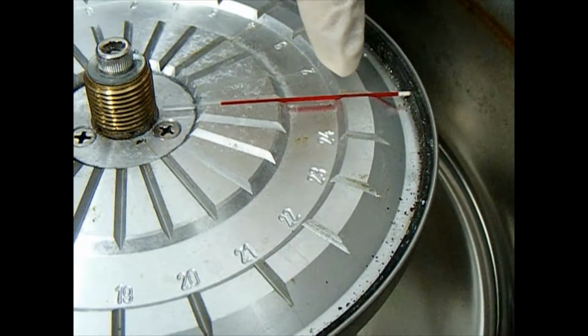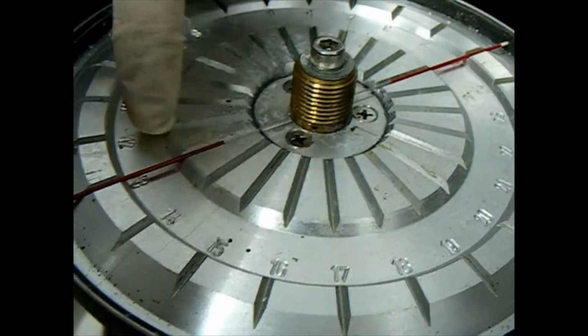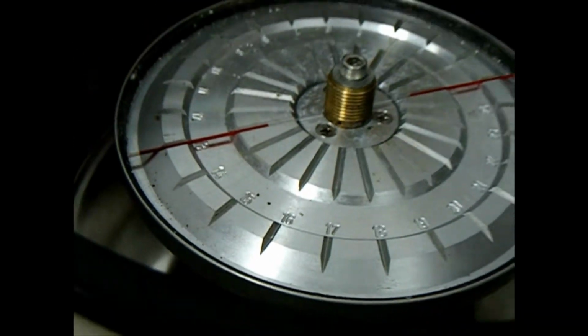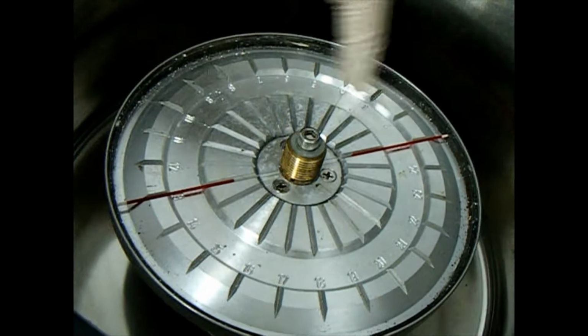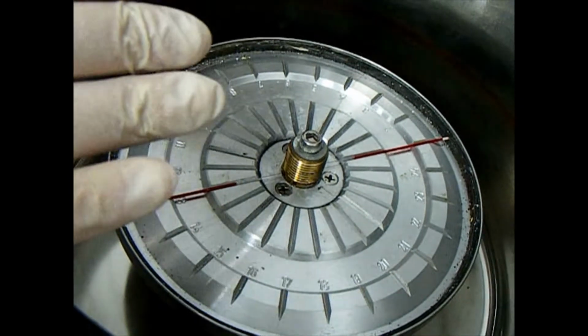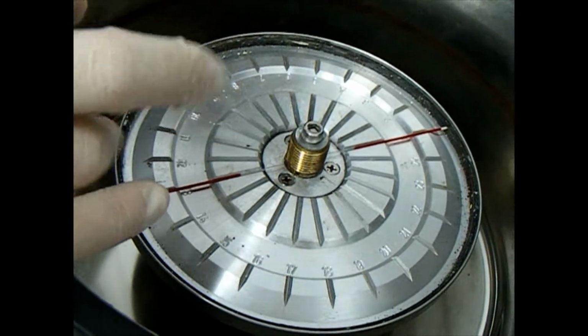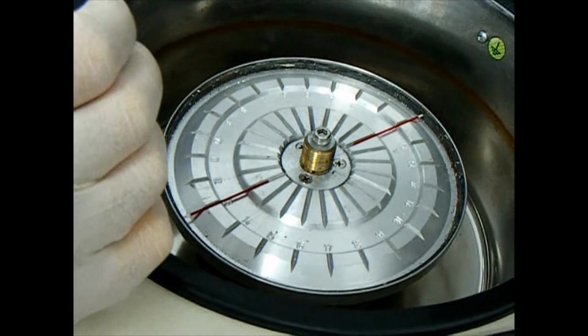So I've put it in number 1, and I've put it in the exact opposite, which is number 13, with the plug on the outside. So it's really important, the plug on the outside and balance the centrifuge opposite. Whenever you do the PCVs, you should always do multiples of 2. So do 2 or 4 or 6 or 8 so you can balance the centrifuge.